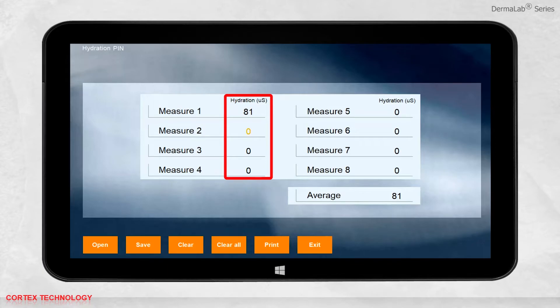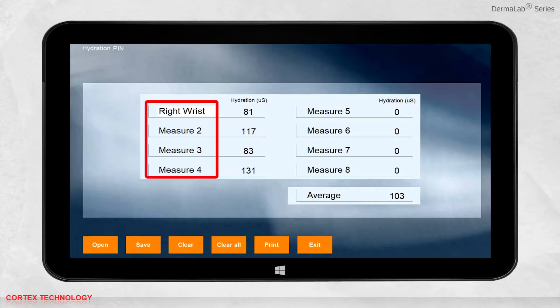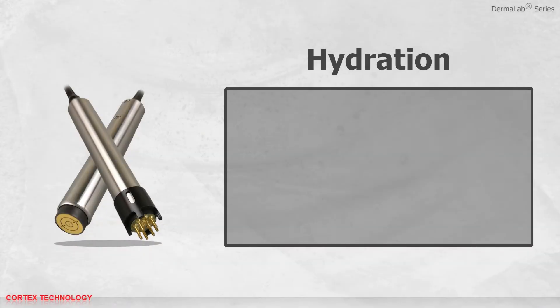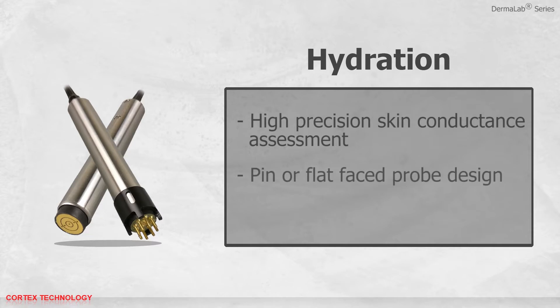The measurement is presented in microsiemens. When taking multiple measurements, the average will be calculated. You can change the name of each measurement, and you can save, print, or open previously saved data. Hydration offers high precision skin conductance assessment. Choose between pin or flat faced probe design, and both come with a spring-loaded action to trigger the measurement at a preset skin load.